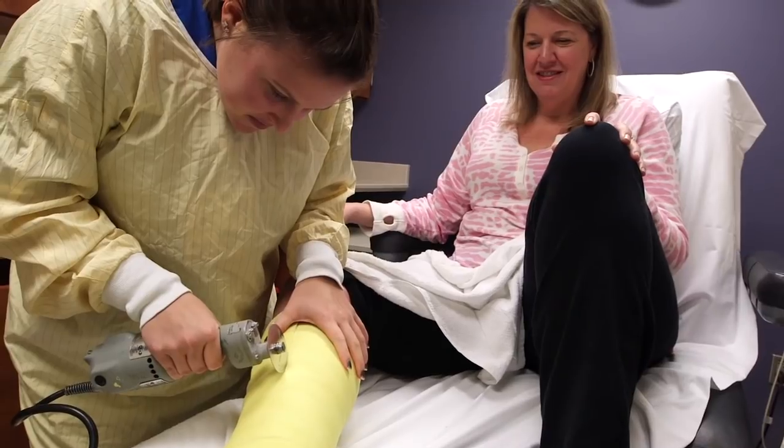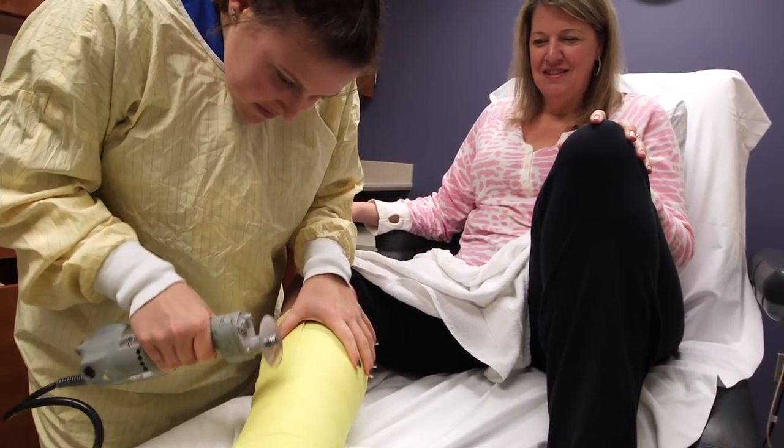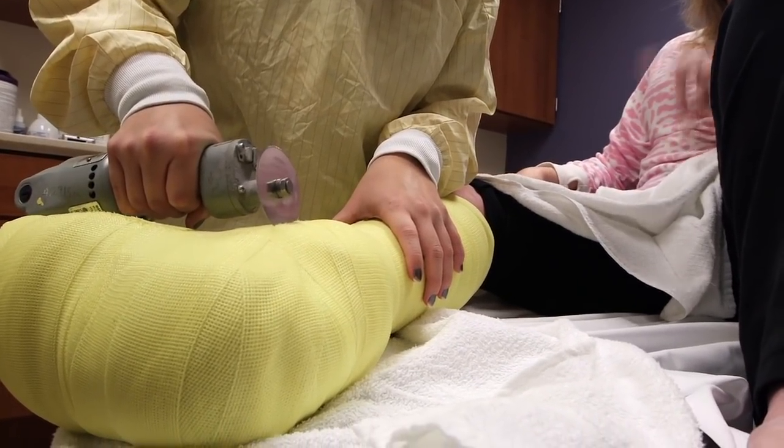Most of our patients have to transition into some form of either a custom orthotic that they wear in their own shoes, or a custom shoe created for their foot.